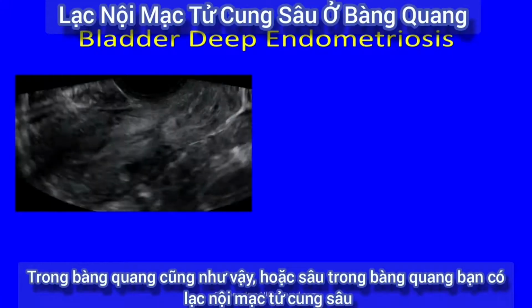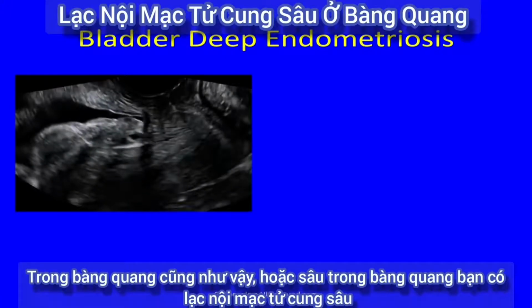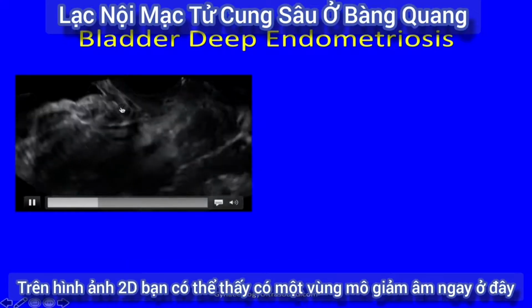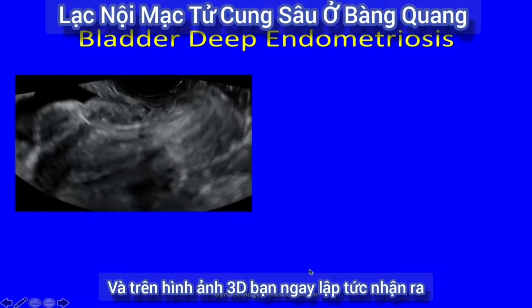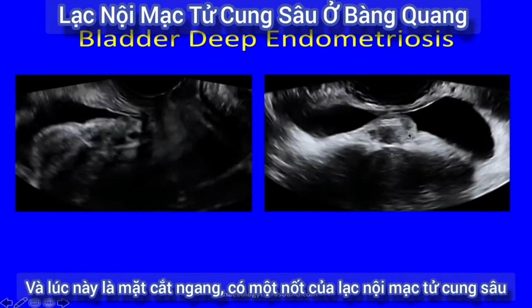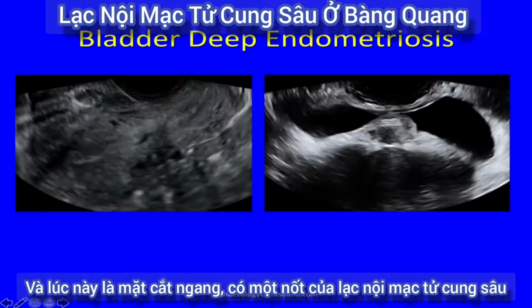In the bladder also, or just deep to the bladder, you get deep endometriosis, and in 2D you can see that there's an area of hypoechoic tissue just there. And on 3D this was instantly recognizable. This is the transverse plane now of a nodule of deep endometriosis.